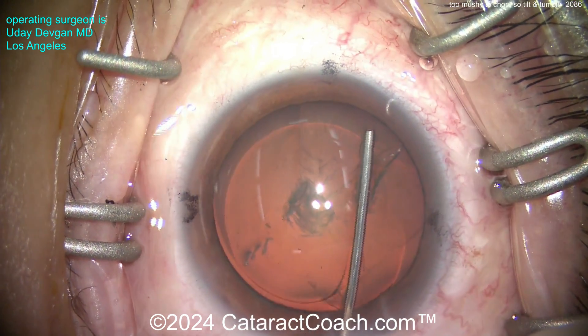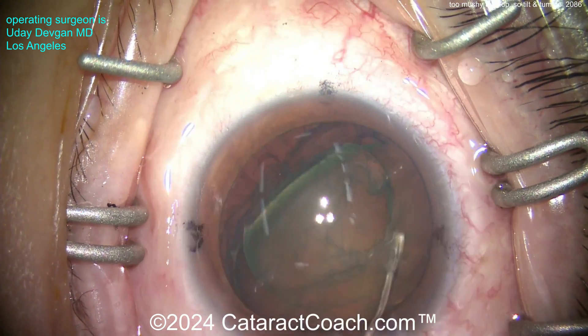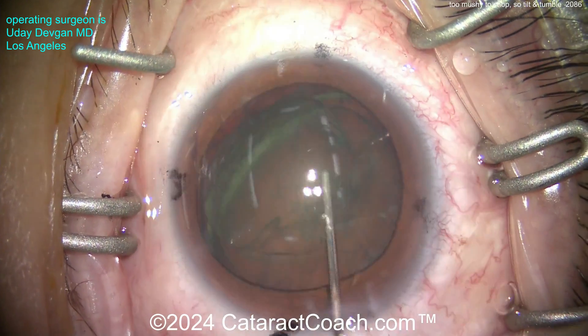Now the important step here is hydrodissection. There's the hydrodissection - we want to get this nucleus tilted out of the capsular bag. Very gentle. That's a five millimeter rhexis again. It's a soft nucleus, not a dense cataract.